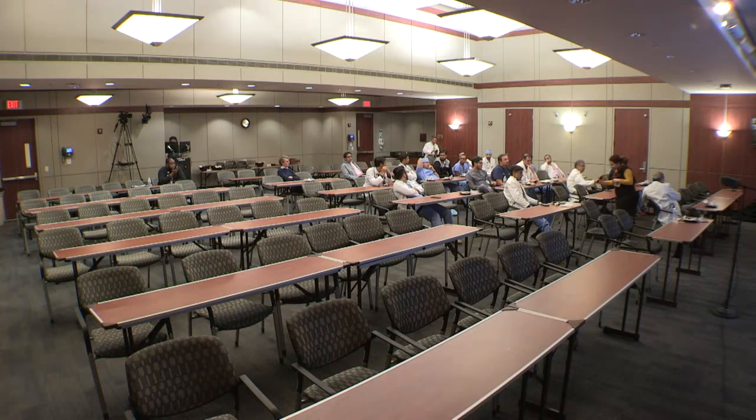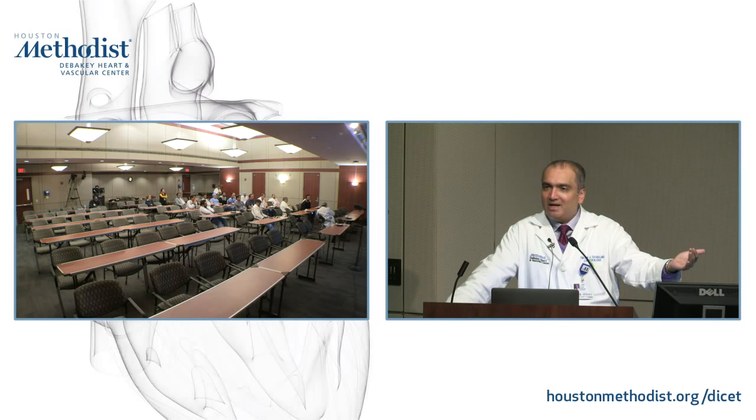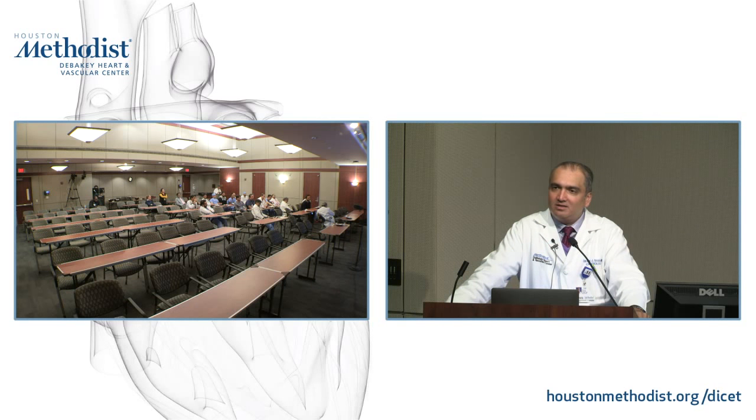Another question, John. Pardon me? No, slow flow in the cavity that's sitting right next to the myocardium. So you see this area of increased signal, but it's hard to differentiate whether this is within the myocardium or within the cavity, mimicking that. Okay? All right, thank you.